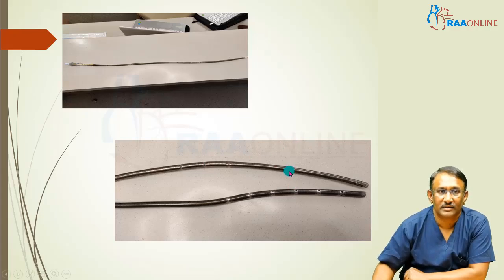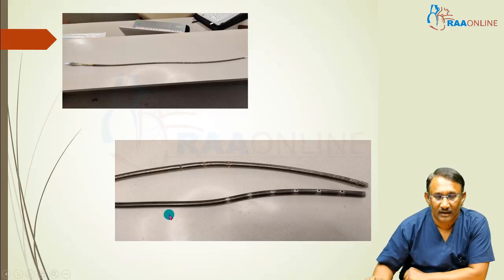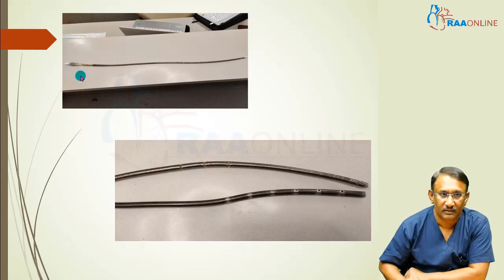Then you need to know the length of the cannula. They all have markings here. We cannot see that very clearly. Those markings will tell you the length from the tip or the distal end, like 30, 40, 50 centimeters. That helps you to know how deep you are inside and also to mark the point where you have fixed the cannula at the skin level. Then you need to know the size. On every cannula, it will be clearly marked what the size of the cannula is. So obviously, that's what you look at when you make a choice, what size of cannula you want.